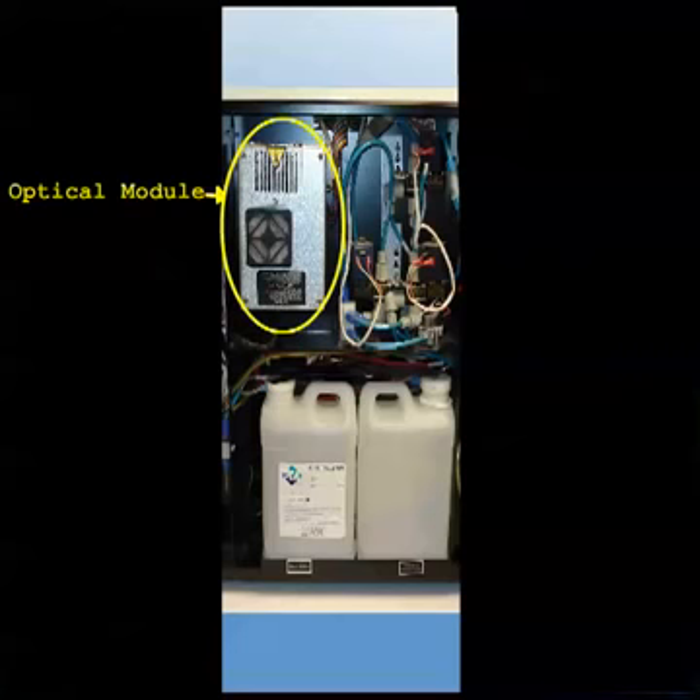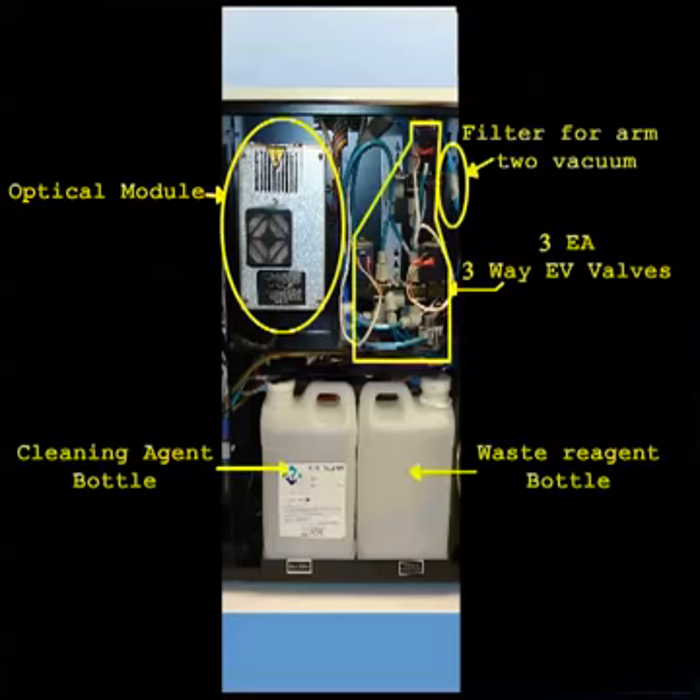At the top center section, you have the optical module, which supplies the light for the chromogenic tests. To the right of that are the EV valves for arm number two, which moves the cuvettes from the shuttle to the wells.